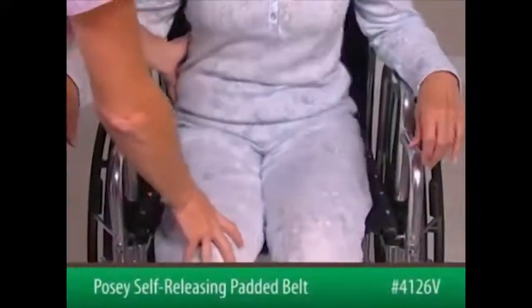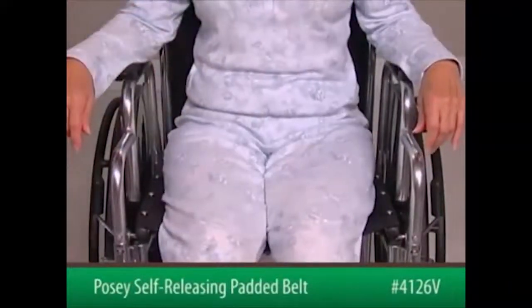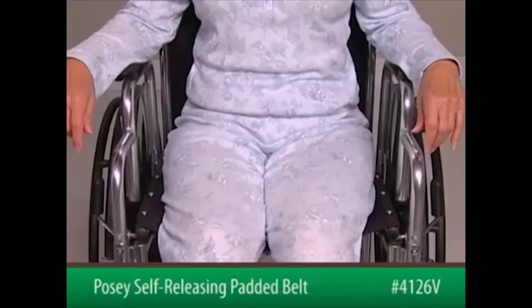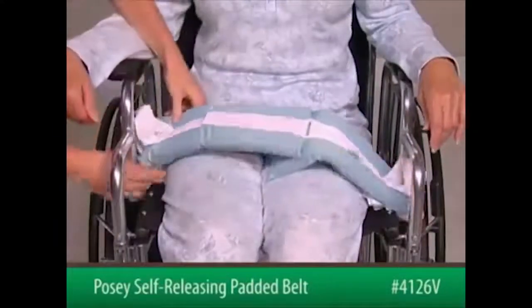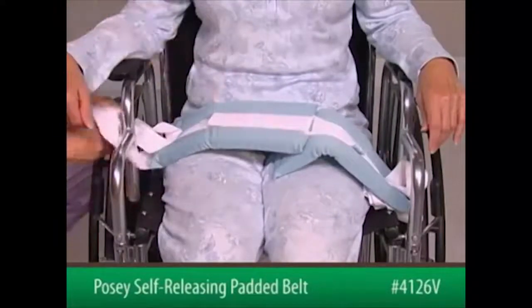To begin, position the patient as far back in the seat as possible. The patient's buttocks should be against the back of the chair. Lay the lap belt across the patient's thighs with the foam facing in.